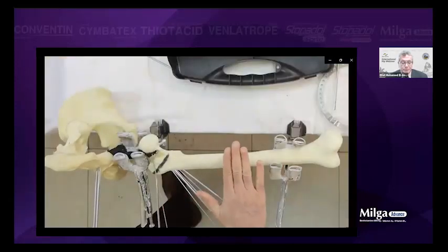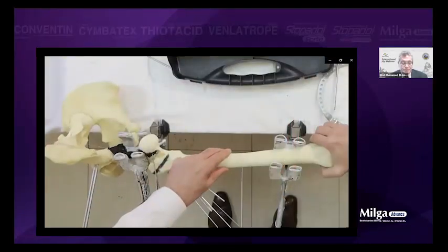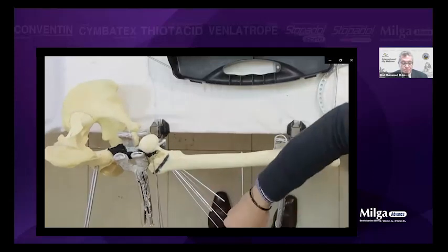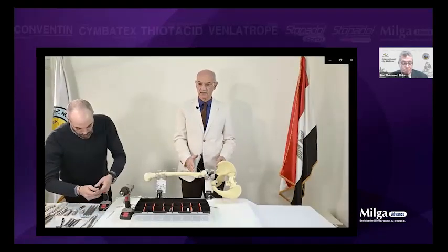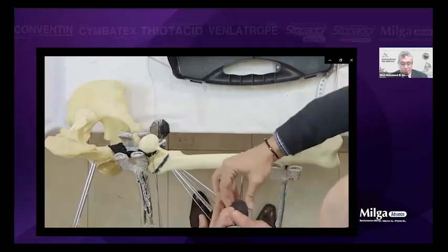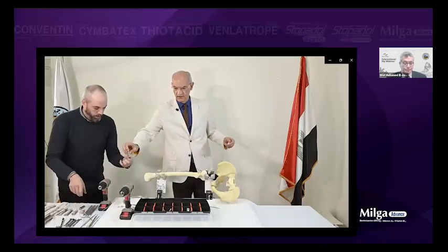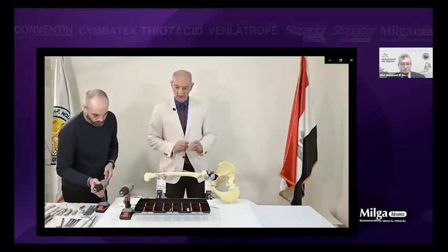Coming to the distal femur, you can use 2 half pins, 3 half pins or whatever, vertical to the bone. Another half pin. So this is the distal femur, and this is the proximal femur. So you can use two half pins in two different directions and so on. For each Schanze screw, you have to do the drill bit first. Show me the drill bit. And then when you use it, you can apply manually. This is the real operation.